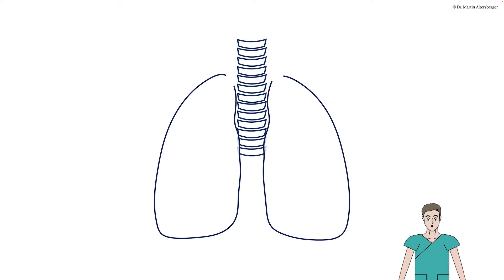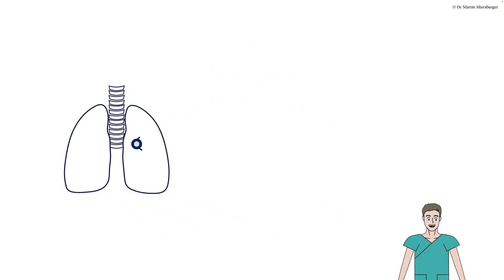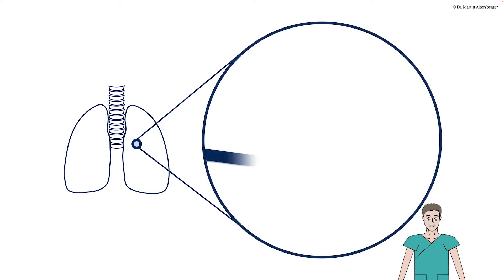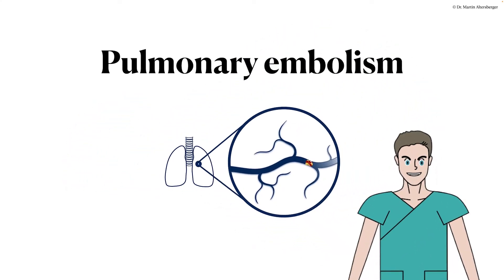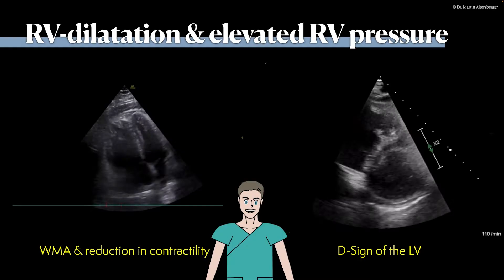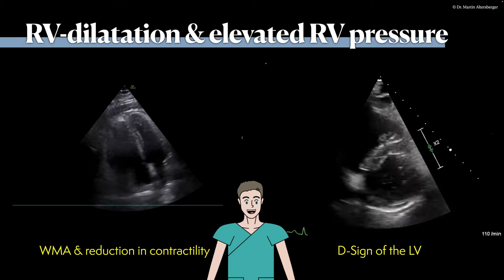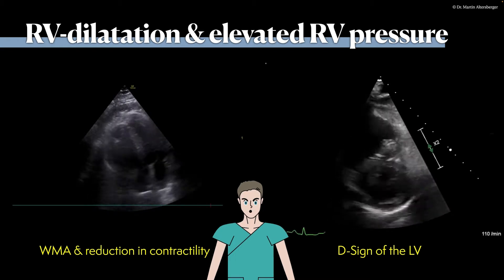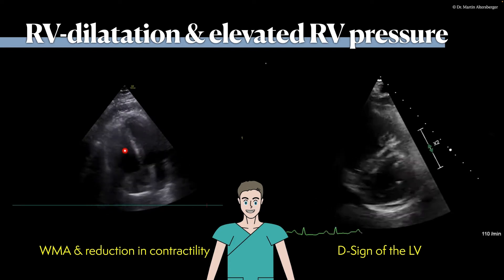A possible cause for right ventricular dilatation and hemodynamic problems of the right ventricle is a very important pathology: pulmonary embolism. In pulmonary embolism or lung infarction, you will see that the right ventricle is dilating because there is a pressure overload. In this case, we do see that the right ventricle is severely dilated.